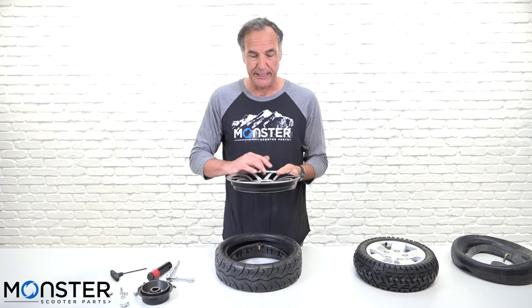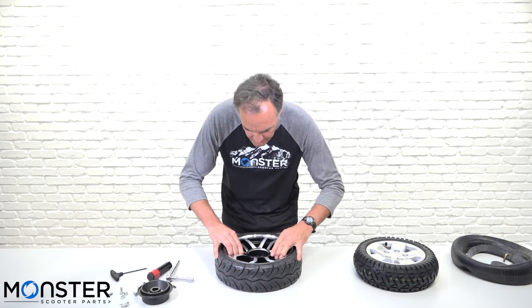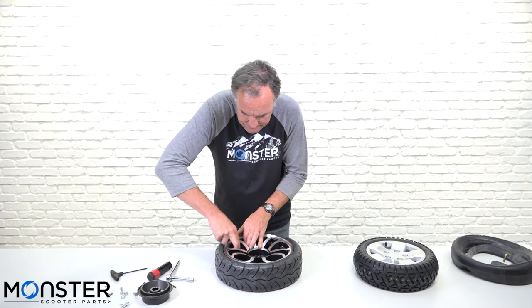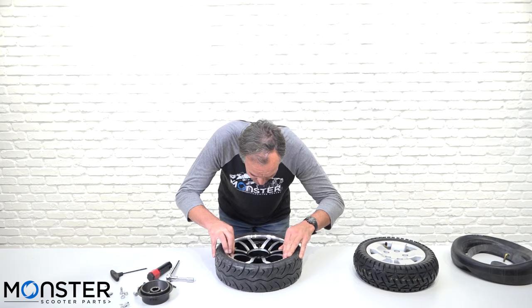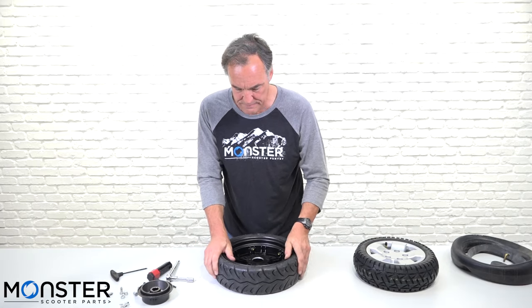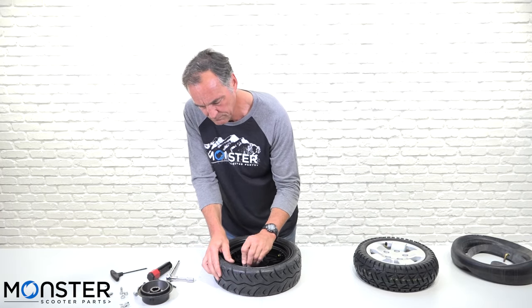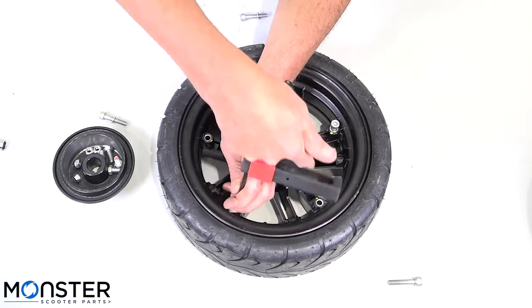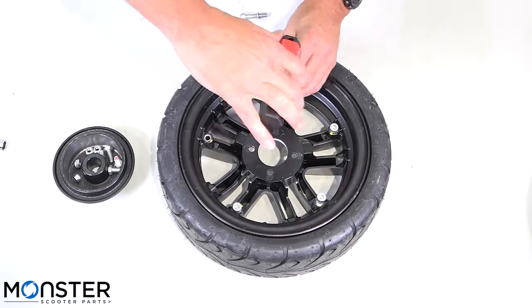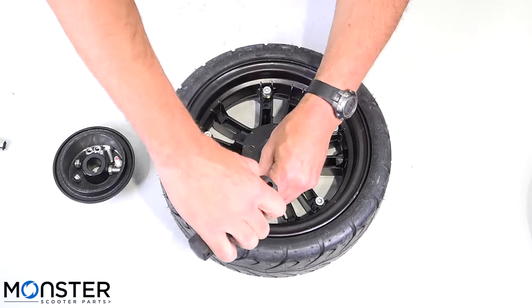You don't want to put it back together and put air in it and have it rip apart on you. Once you have that done, you can go ahead and put the rim back together. Just be aware of where the bolts go on the side of the rim. Always check before you put the screws back in that nothing is in between the two pieces of the rim. Assembly is the opposite of disassembly — go on opposite sides of the rim when you put these screws back in and snug them down. Just snug them down the first time and then give a little bit more tightening once everything's snug.